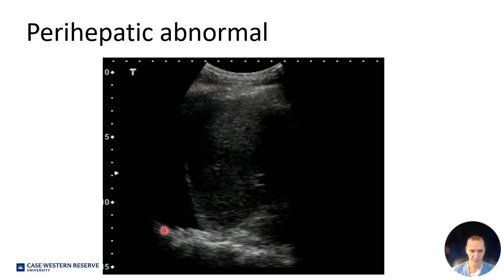They don't get scattered. They go through the free fluid. They hit the spine and then reflect back. So this is called the spine sign, and this is indicative of fluid around the lung in the setting of trauma, hemothorax, in the setting of a medical diagnosis, this could be a pleural effusion.